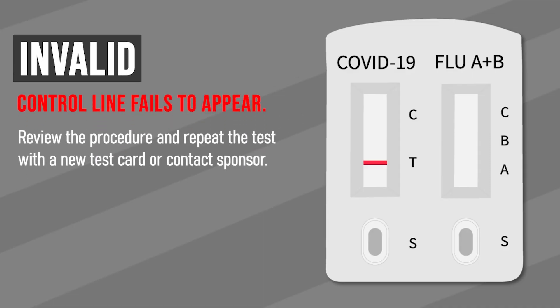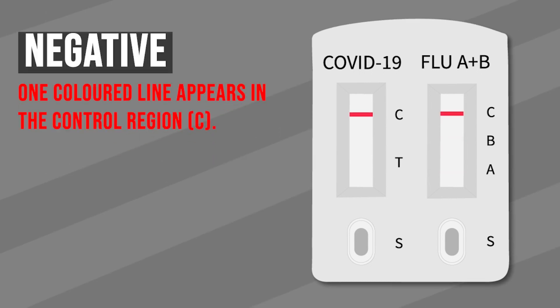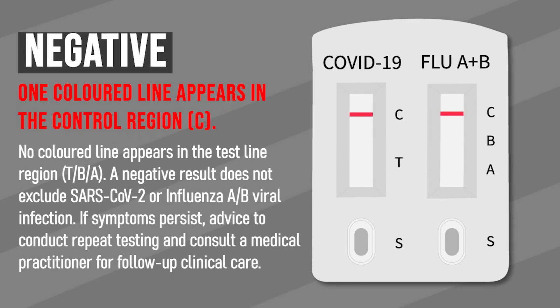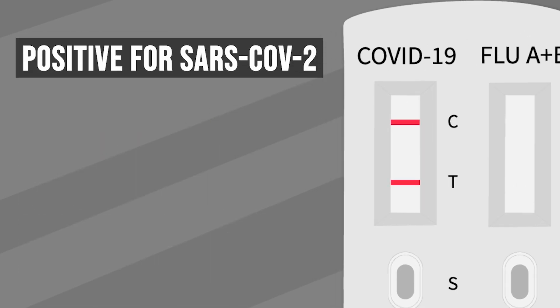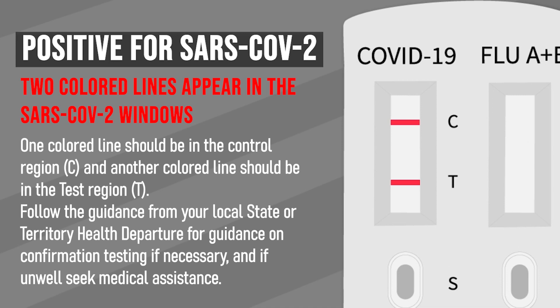We are almost done. If the test is invalid, the control line fails to appear — this indicates an incorrect procedure. If the test is negative, one colored band appears only in the control zone C. If the test is positive for SARS-CoV-2, two colored bands appear in the control zone C and another in the test zone T.